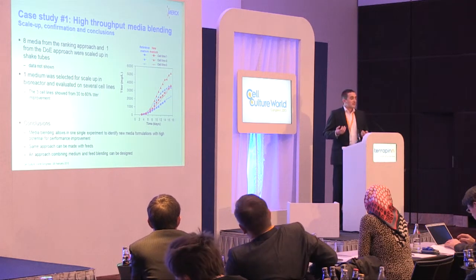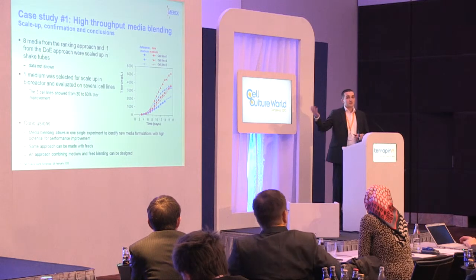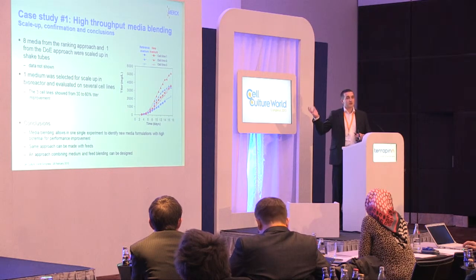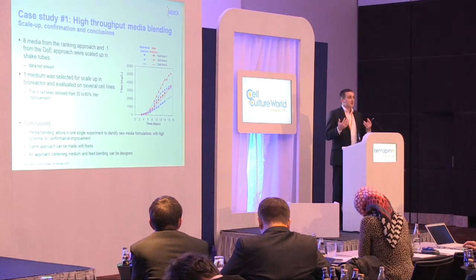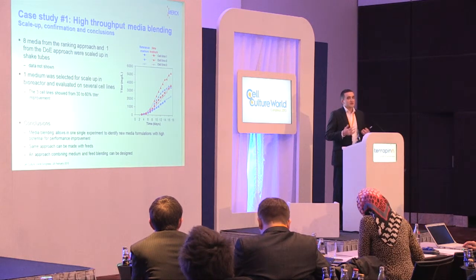And we can even imagine a combination of both blendings. If you take the result from this experiment, 5 formulations were really important to drive our performance up. If you take the result from the feed blending experiment, maybe also 5 formulations will be interesting. You take these 10 formulations, we mix them together, and you maybe obtain something really, really interesting.